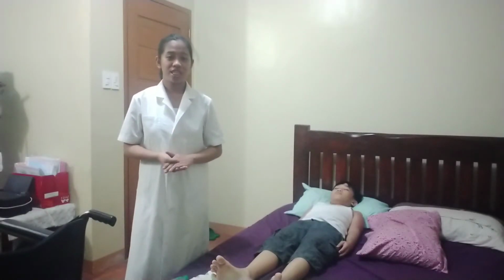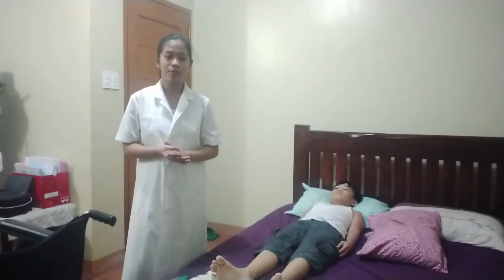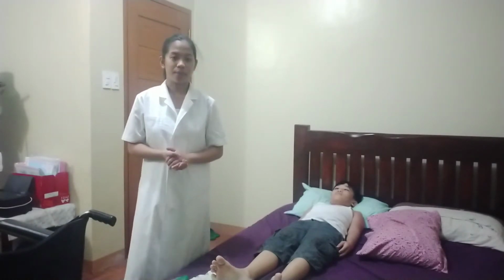Now I will be transferring a patient from a bed to a wheelchair. The goal of this procedure is for the transfer to be accomplished without any injury to the patient and to the nurse, and the patient is free from any complications in relation to immobility.